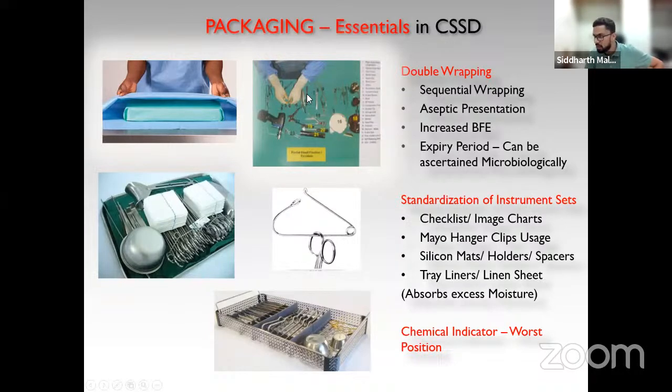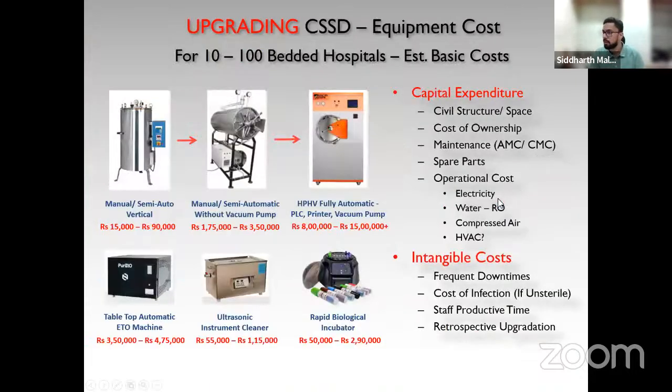These are very large charts which sir has placed inside and near his OT and CSSD area, which is a very good practice. It may take years for you to build this, or you may take from Rajendra sir also. And once this is actually used, you can be assured that your OT technicians will provide you every instrument which is required in a tray. Nothing will go missing. All right.